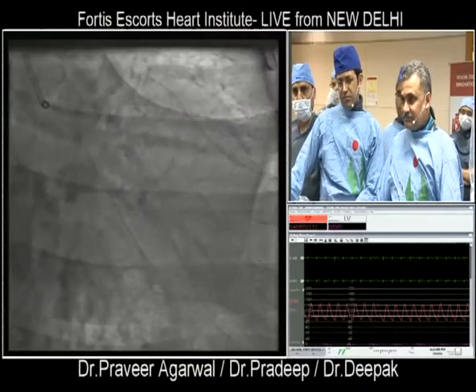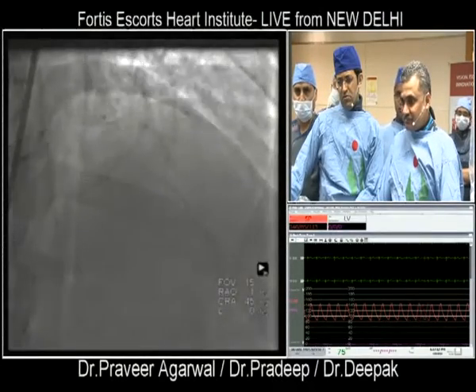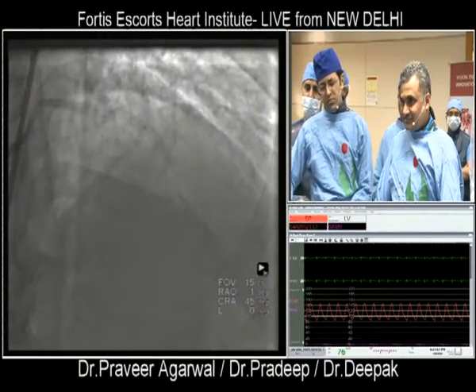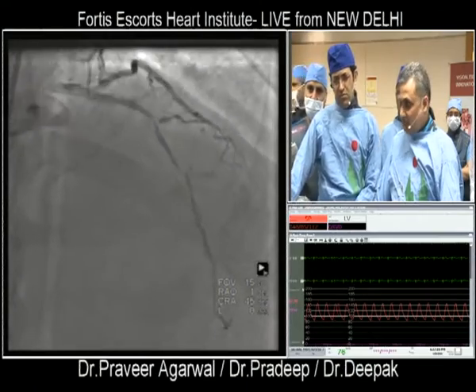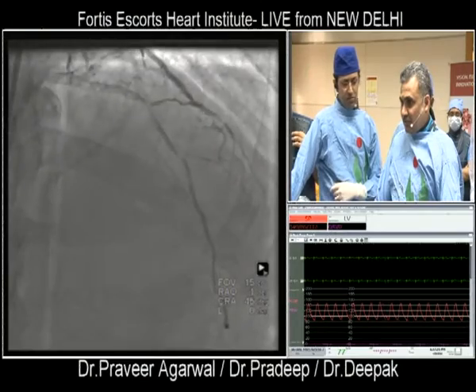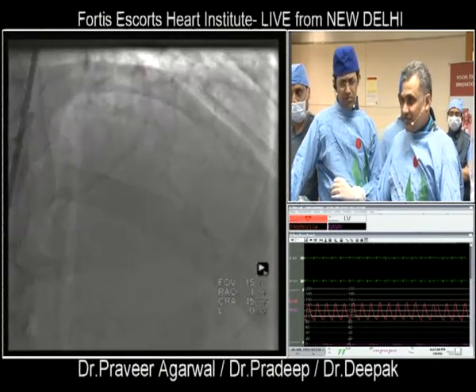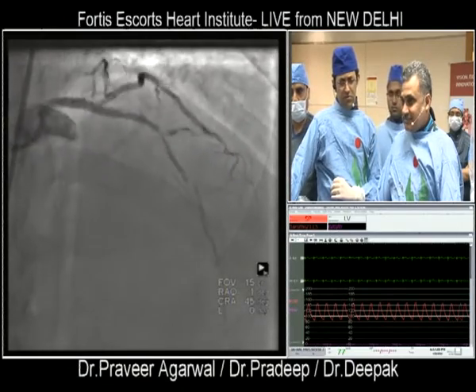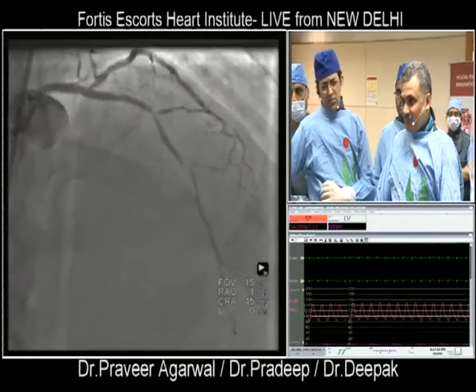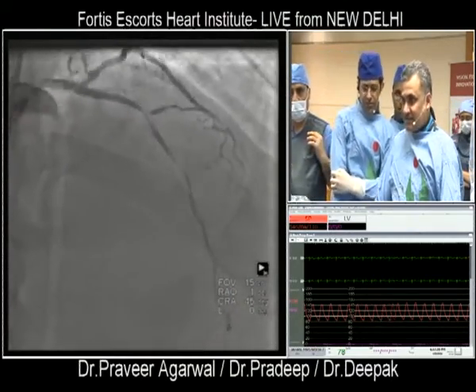Next, please. Do you want to touch both lesions in the LAD, the one located at the LAD origin and this distal one as well? I'm not hearing you. You have two lesions in the LAD, one at the site of the origin of the diagonal branch, and the second one below, which is also tight. So I understand you want to target both lesions, yes? Certainly, yes. Okay.